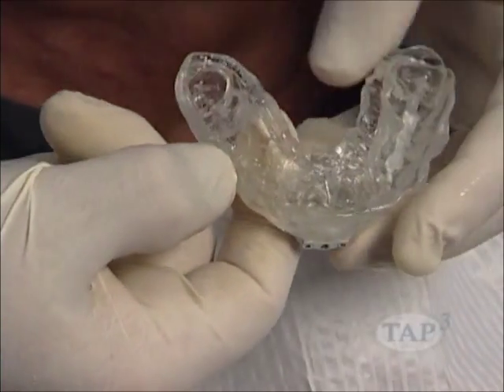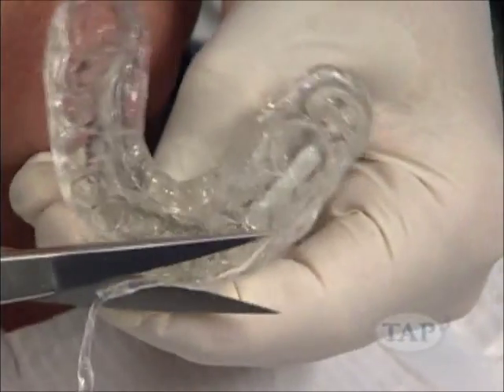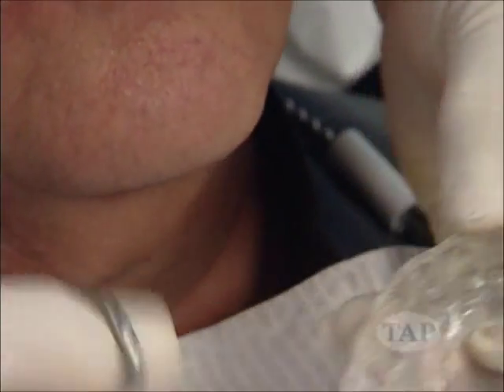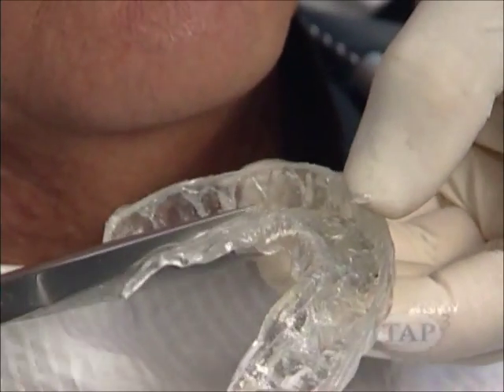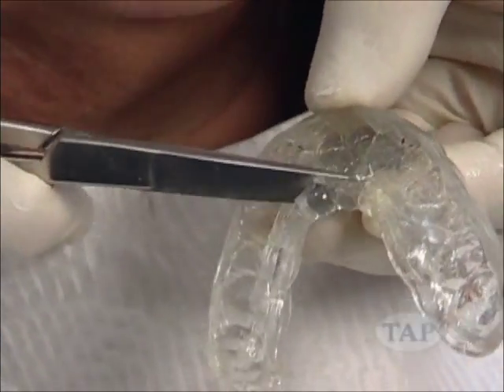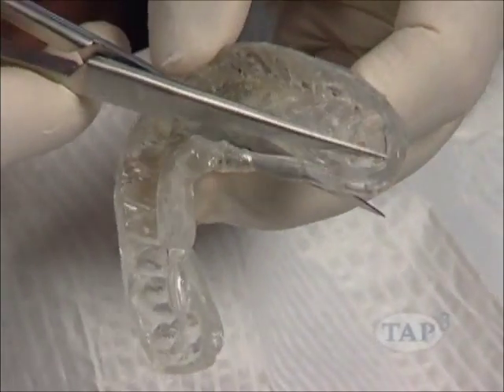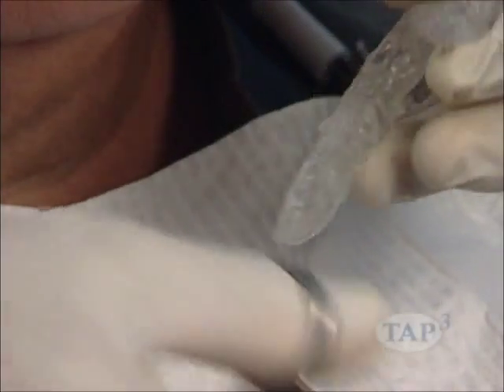Observe the excess material. While the thermocryl is soft, trim away all material beyond the edge of the hard shell with curved scissors. Use the edge of the tray as a guide. Make certain there is no material on the gingival. Smooth the edge of the tray with a wet finger. Repeat this process as necessary.